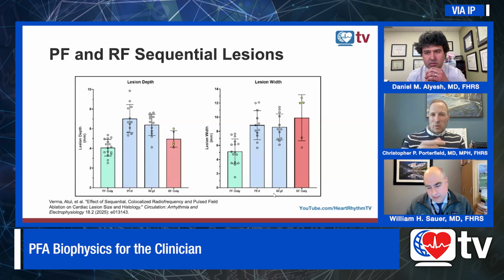So you apply these short, either biphasic or monophasic sequences. The monophasic, especially monophasic unipolar sequences, with a longer sequence, with a unipolar configuration, you'll have more thermal energy. There's just going to be more heating. With the biphasic, I like to say multiphasic instead of biphasic, but biphasic short pulses with a fairly long delay between the delivery allow for this dissipation of thermal energy.